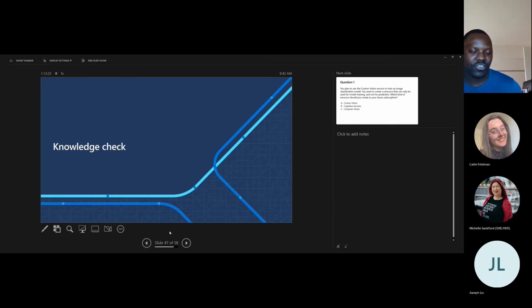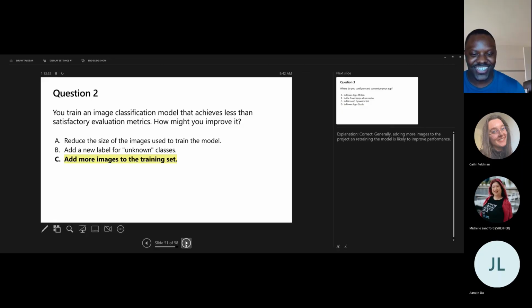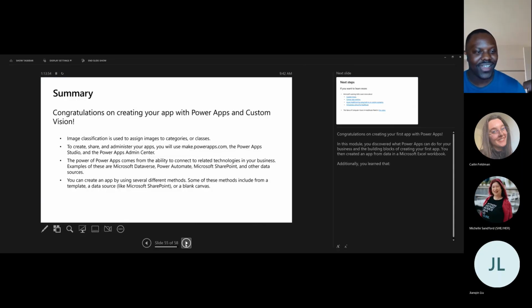And of course, we've also seen how important it is to have a representative sample, so that you can have unbiased data and remove as much bias as possible and have something representative that can give you an accurate prediction. As well, you can tweak your training time and other parameters so you can have an accurate model that can be suitable for this kind of work. So that's it. I think I will skip the knowledge check just because of time.